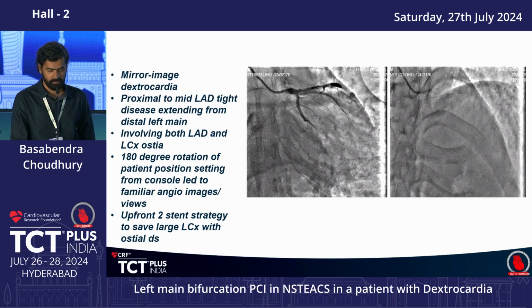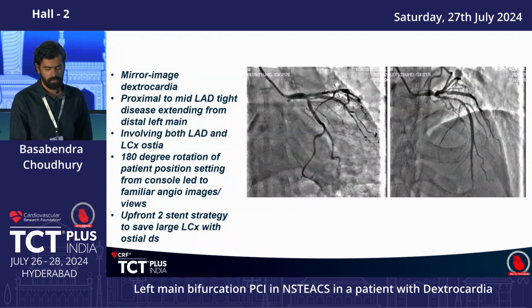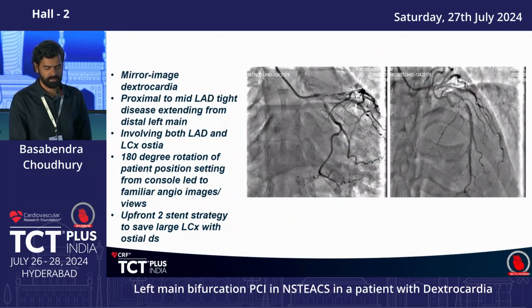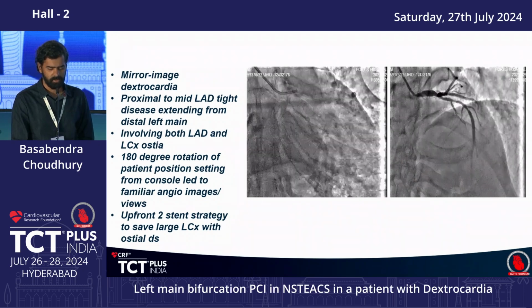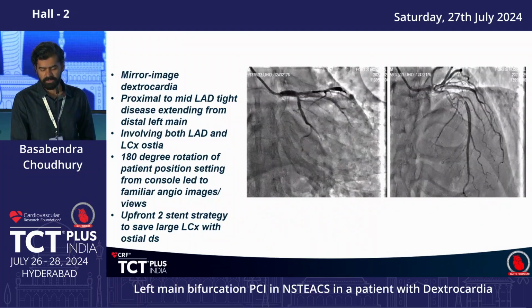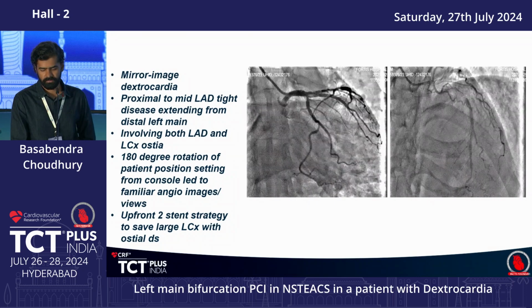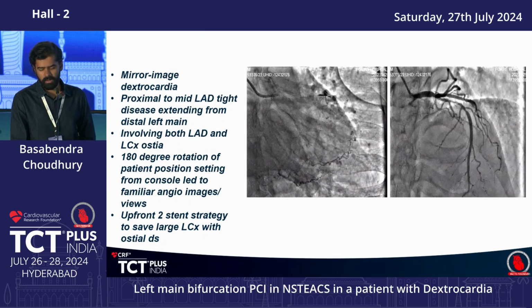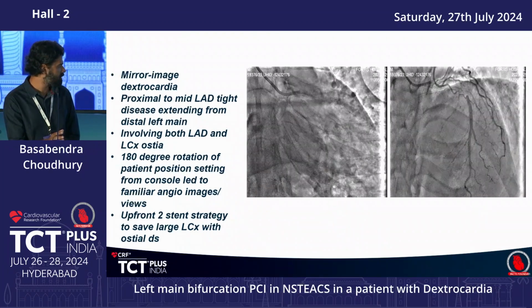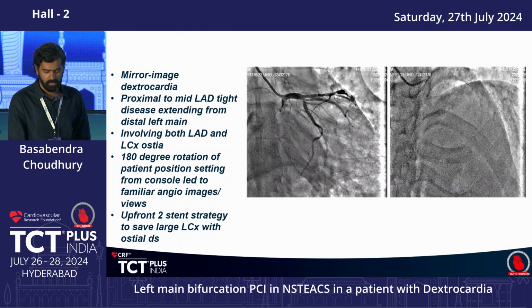What view is this, the right one? Can you tell me? Which one, sir? What is the angle on that right view? Sorry to interrupt. This was somewhere between AP caudal and spider caudal. The right picture. What is the exact angle that you have taken? Is it RAO or LAO? This was slightly with mild RAO position, not LAO.